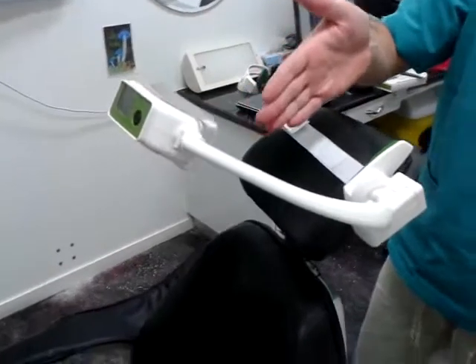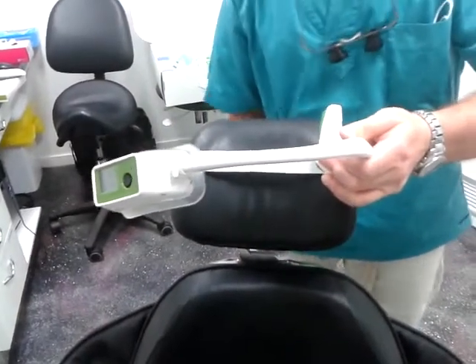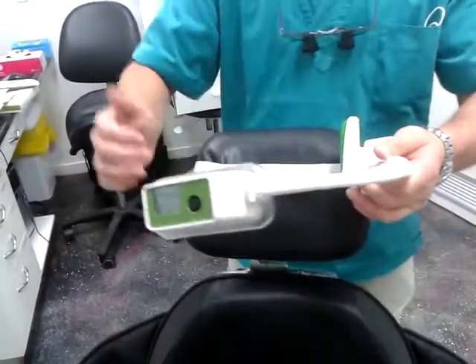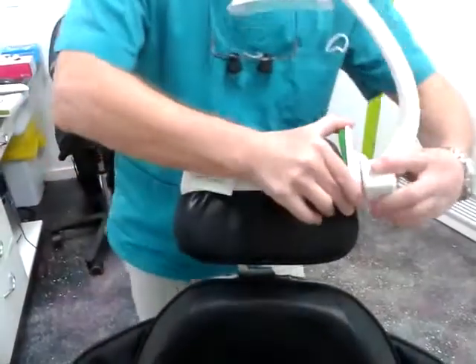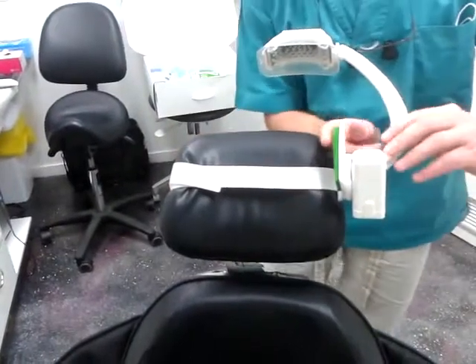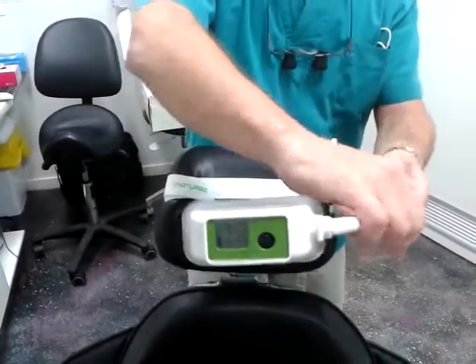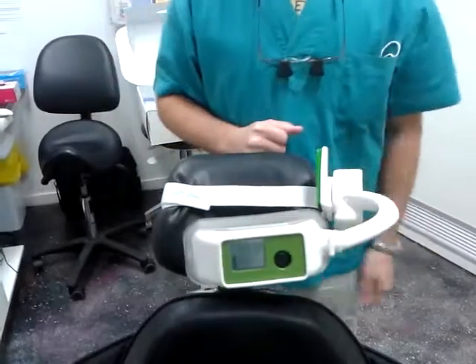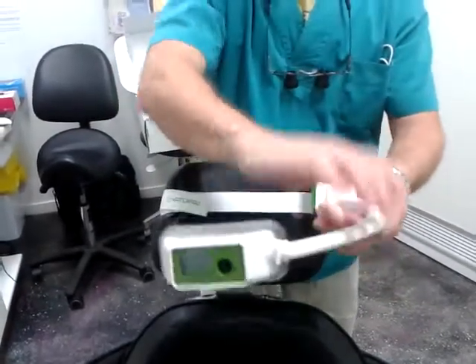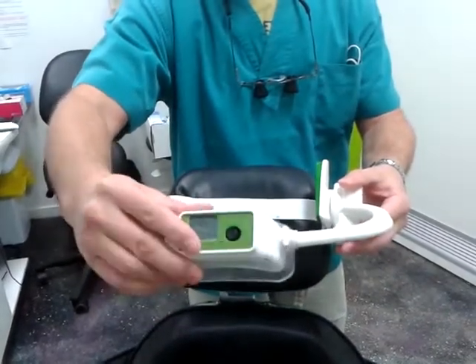Now we need the lamp centered, so please push it to the right and tighten. With patient out of the chair and patient in the chair, this part is flexible so you can flex it to center it, or flex it outwards and again inwards. This piece is also movable up and down.